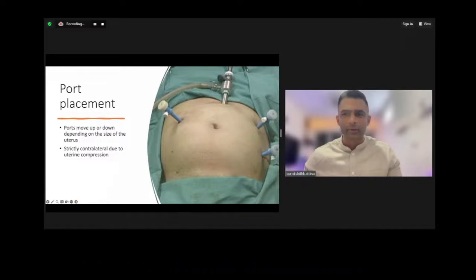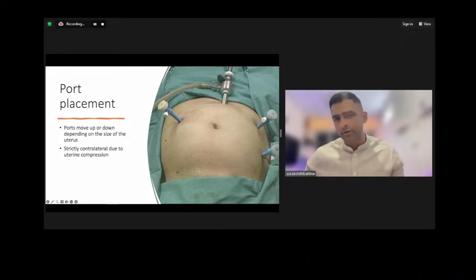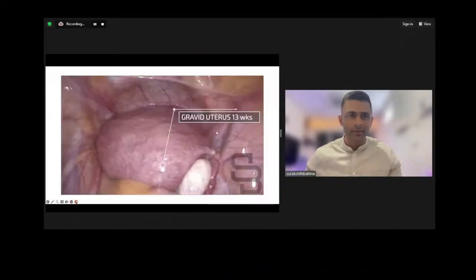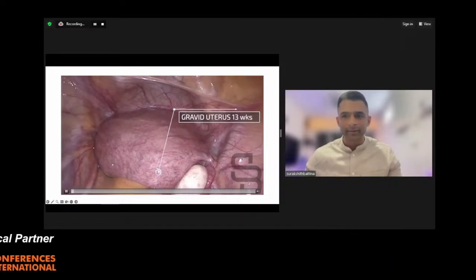The port placements are quite simple since I'm a contralateral surgeon. My ports are contralateral, and I think this surgery is also a contralateral surgery because when the uterus is so enlarged, it's very challenging to do this from an ipsilateral angle. And here is the procedure video. As you can see, we have a gravid 13-week uterus here.